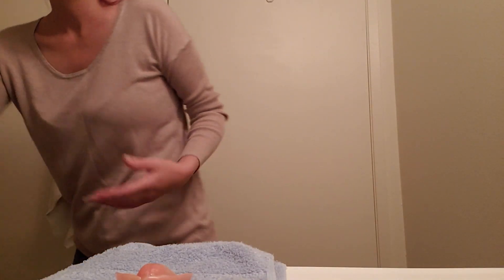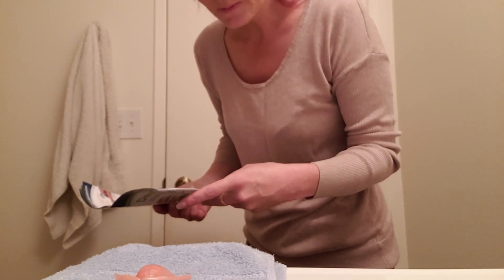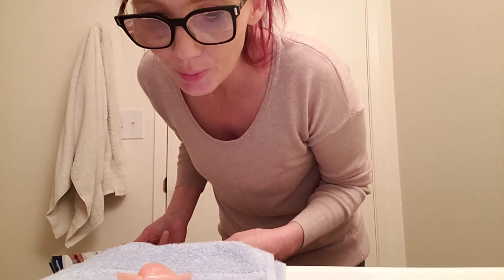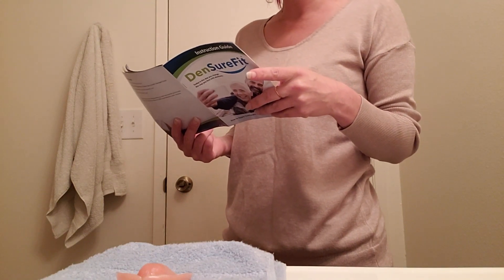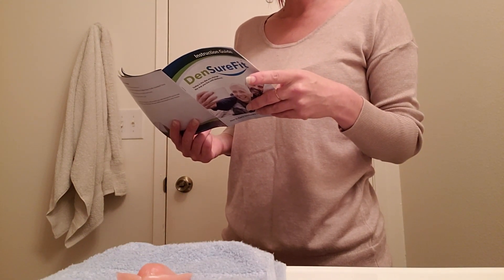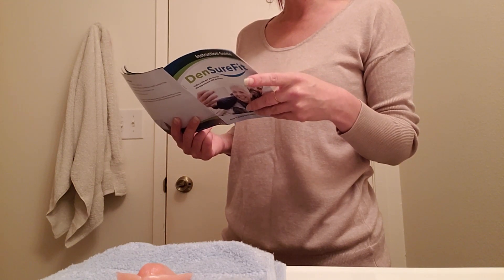Okay, rubbing alcohol — check. I guess I have to let that dry. I'm not sure when it would be completely dry; I don't think it should take very long. And it notes that denture cleanser is not sufficient for this job when prepping your denture prior to relining.